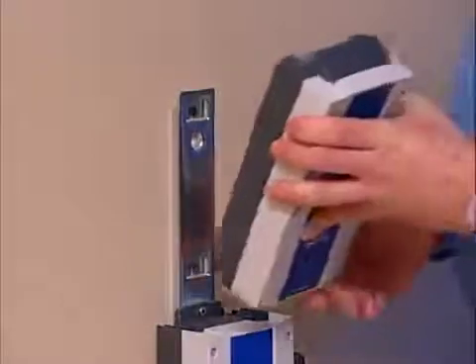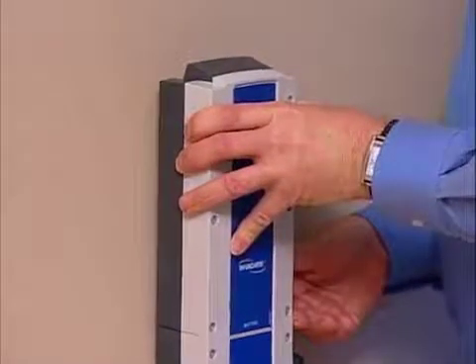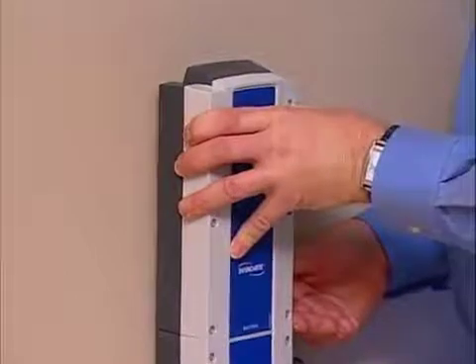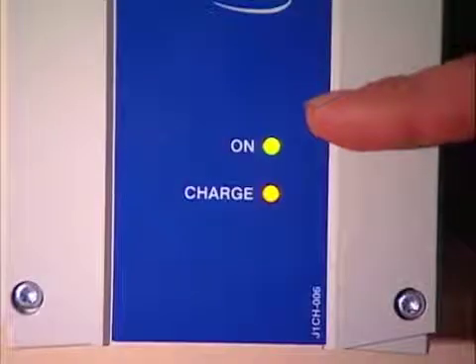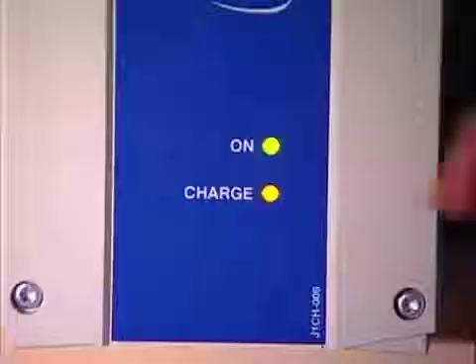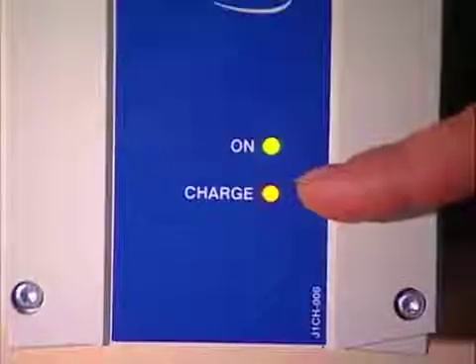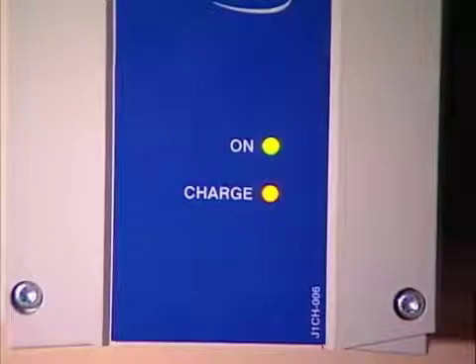Place the drained battery on the battery charger the same way. Just slide it down and push it away until you hear it click. If the charger is plugged in, this green light will be on. And if you have properly installed the battery, this LED will light up to let you know that the battery is being charged. When the battery is fully charged, the LED will go out.